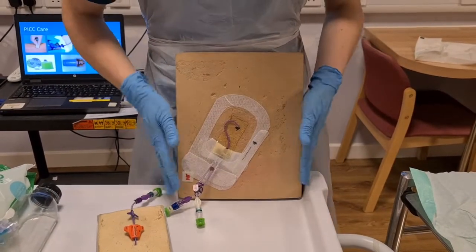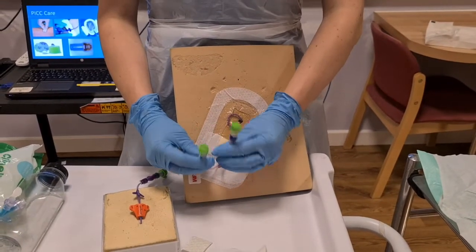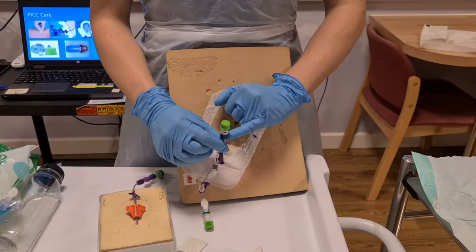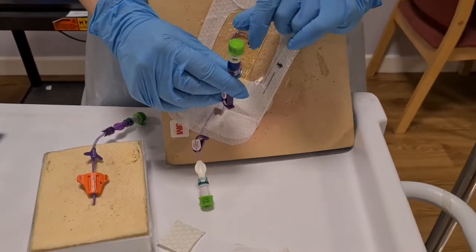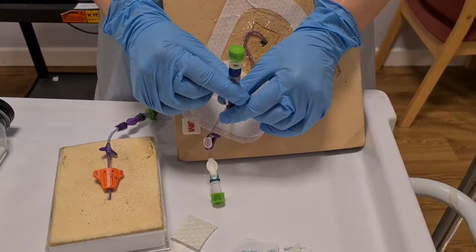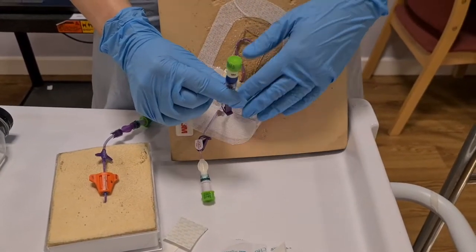Right, almost there. Last but not least, you need to change the Bionectors. On one side we've got a green Bionector. Green and orange are exactly the same, so you can put any medication through them. This here is a TPN Bionector. It has TPN on it to warn the nurses that this line is for TPN only, so it's a designated line for it. The reason for that is TPN is high risk of infection, so you do not want to be sharing that line with antibiotics and all sorts of fluids and other medication.